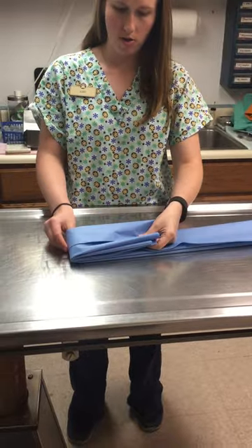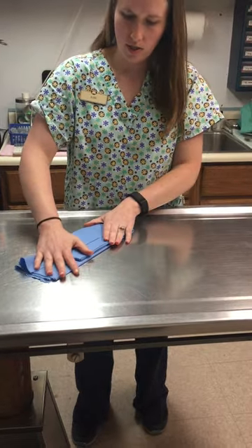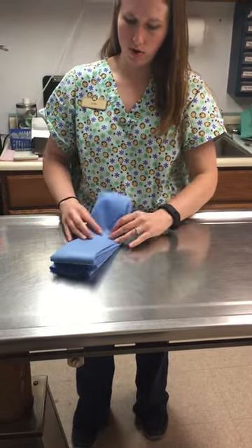And then I'm going to accordion fold it this way, so that way when the surgeon unfolds it, it'll be easy to get apart and separate it.